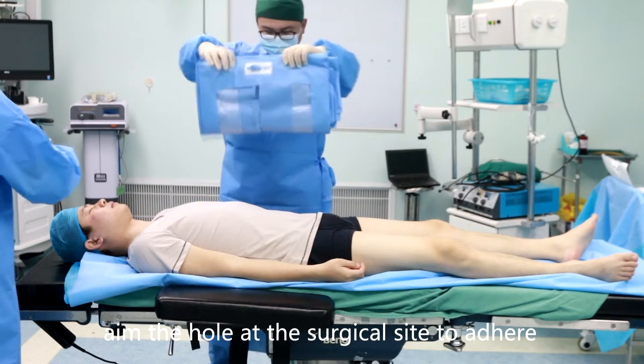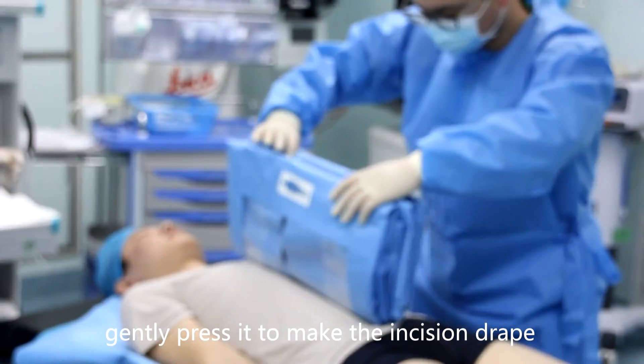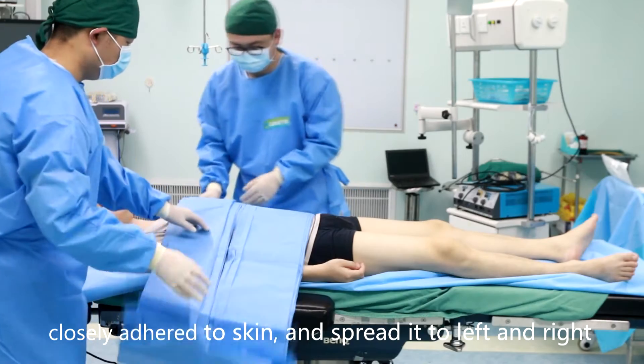Aim the hole at the surgical site to adhere. Gently press it to make the incision drape closely adhered to skin, and spread it to left and right.